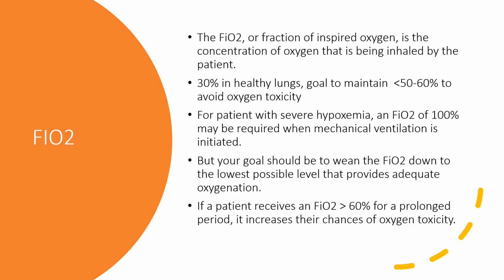So the goal of using FiO2 under normal conditions: you could get by with 30% FiO2. Someone in cardiac arrest, you could give them 100%, but then you really want to wean down that FiO2.